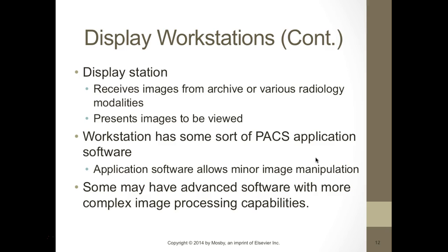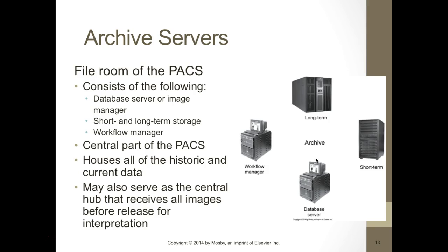So in this chapter, they're showing a lot of Siemens workstations. So you'll see the display stations are mainly Siemens. So some of you guys will recognize that. Application software allows image manipulation. So some have advanced software with more complex image processing capabilities, and we'll talk about that later on.